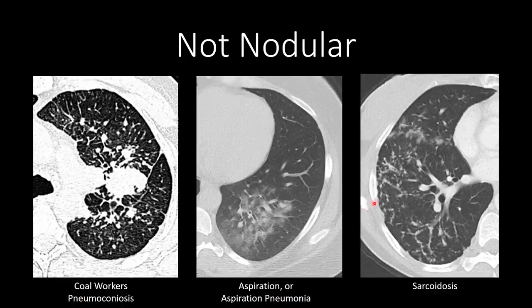Here we have another case of multiple nodules — micro nodules in a perilymphatic pattern in the setting of sarcoidosis. There may be a little bit of patchy ground glass here, but the predominant pattern is perilymphatic nodules. This is sarcoidosis and should not be mistaken for organizing pneumonia.